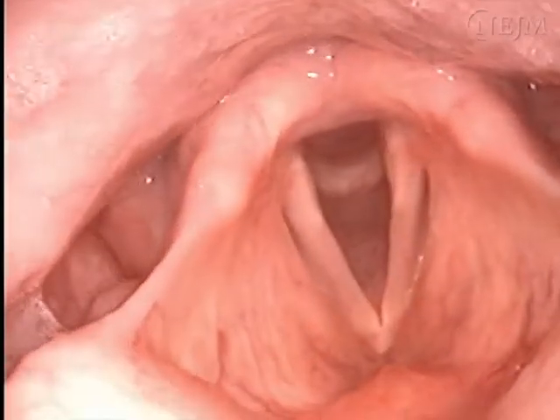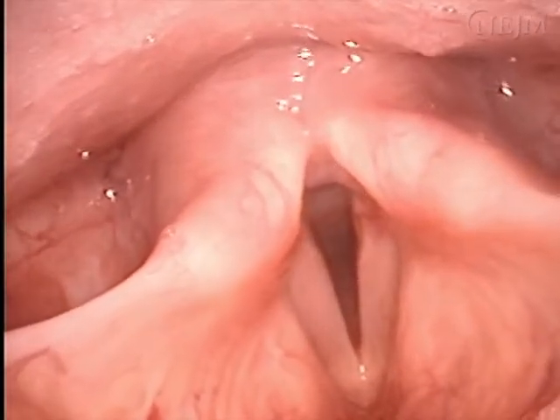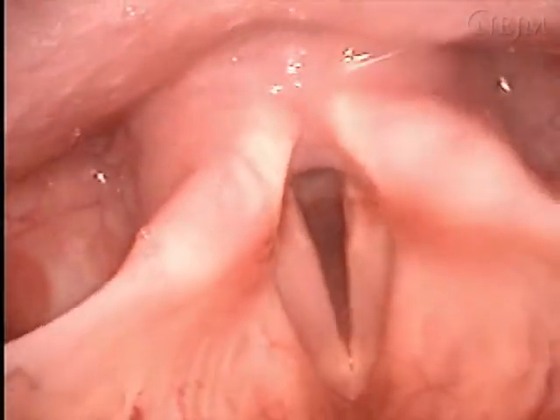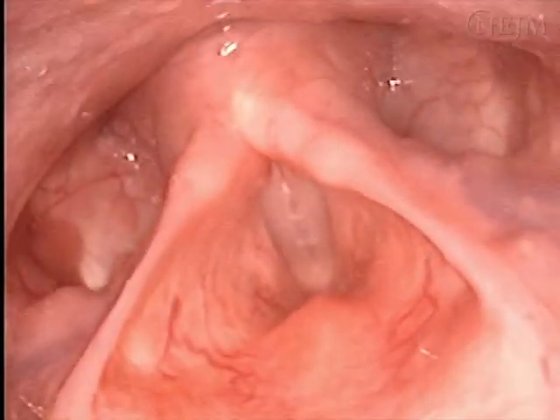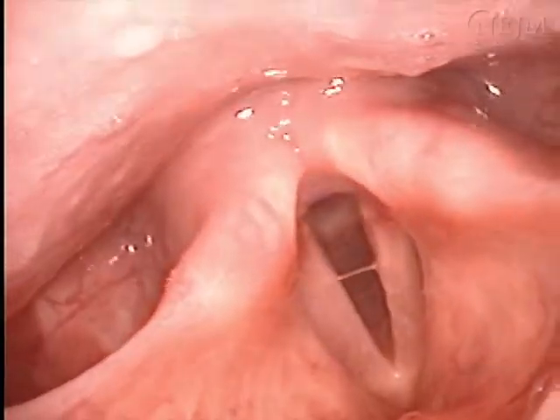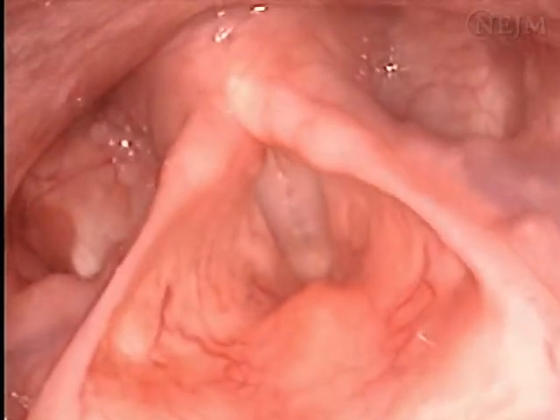Ask the patient to sniff or to inspire deeply through the nose. This causes maximal abduction of the cords, permitting optimal assessment of this important area. Ask the patient to say "ee" or "ah." In the normal patient, the vocal cords will adduct in the middle and come into contact along the entire length, allowing for a precise assessment.